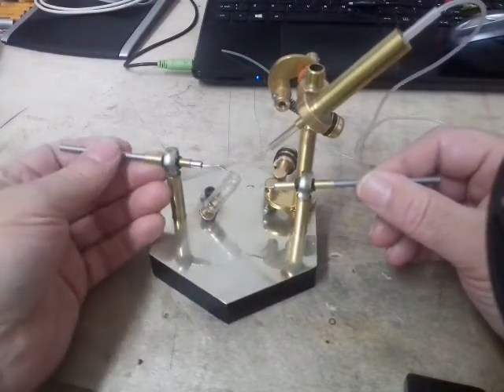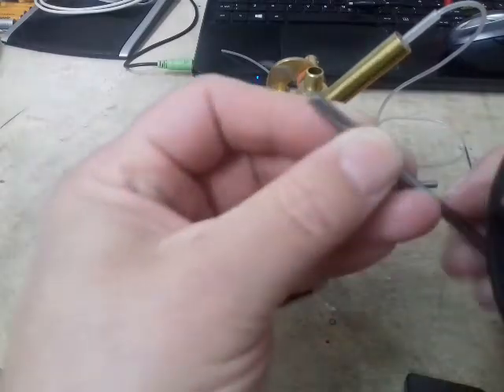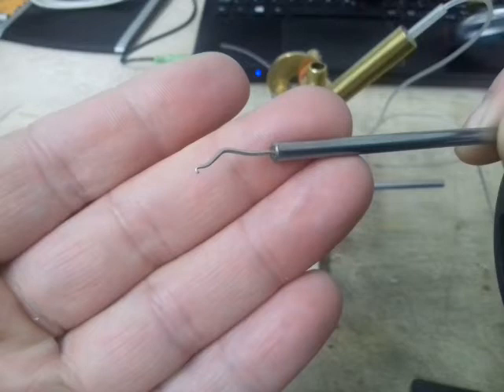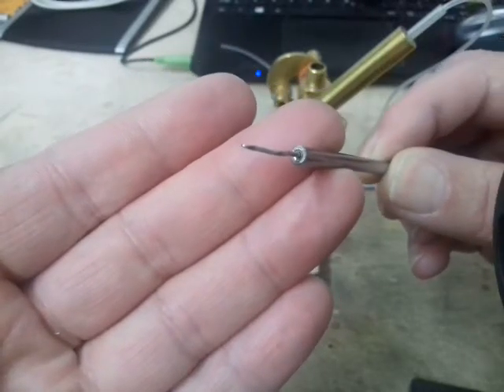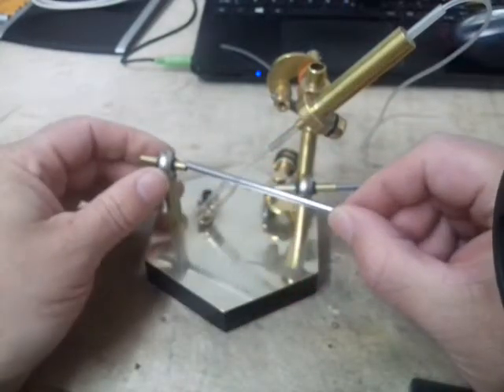The ventral hook is the same. It's a sterling silver piece this time round, drilled into the end of the tube there, and a nice tap fit again. So that's as it was before.